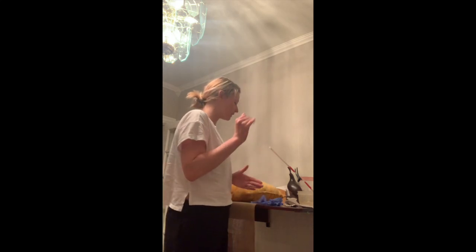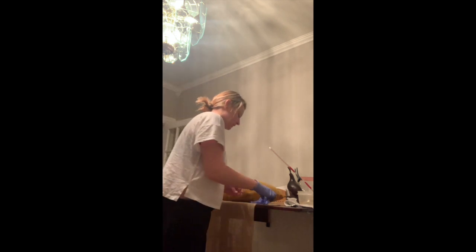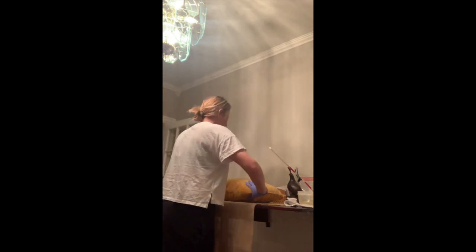I'm going to lubricate the last three to four inches — I lubricated that. Now I'm going to put my gloves on, because the enema is good to go. I'm going to turn my patient onto their left side, and I do have tape on just to be able to show where the target zone is.